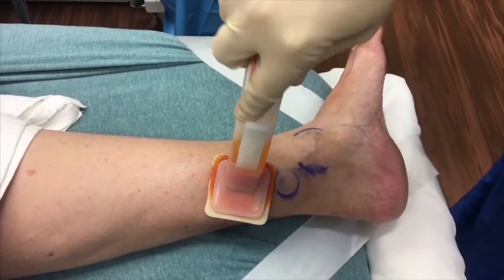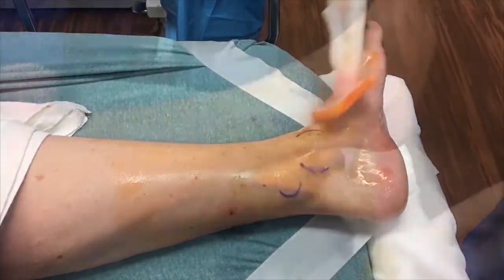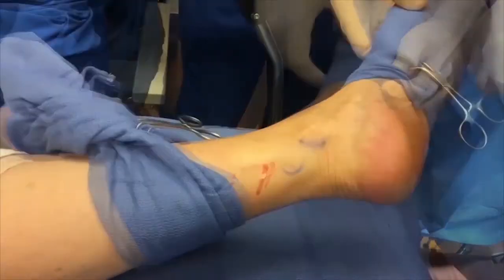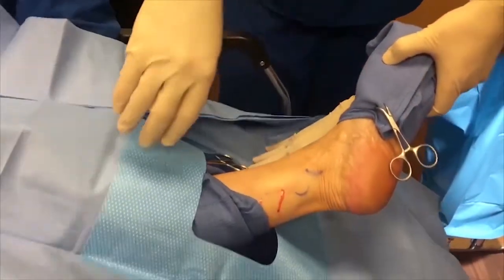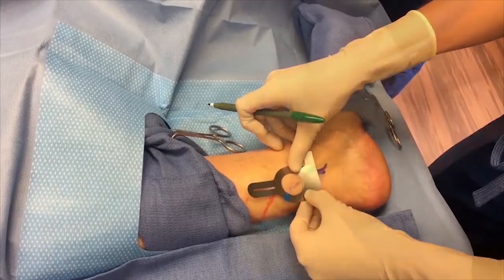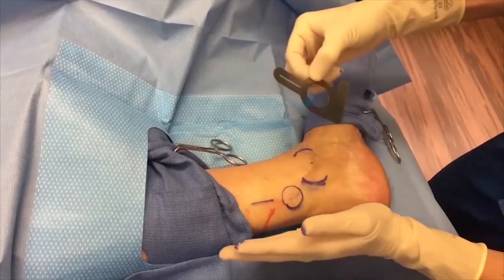Step 4: Sterilize Lower Leg and Drape. Circumferentially prep the foot, ankle, and lower leg with the desired prep solution. Place the prepped foot and leg on a sterile drape or towels, then add additional sterile drapes or towels to square off and create the sterile field. The forefoot and toes should be covered with a sterile towel or sterile surgical glove. Generous, wide draping is recommended. When remarking the implant location, the bottom edge of the template should be parallel to the sole of the foot, and the slot in the template should be parallel to the Achilles tendon.